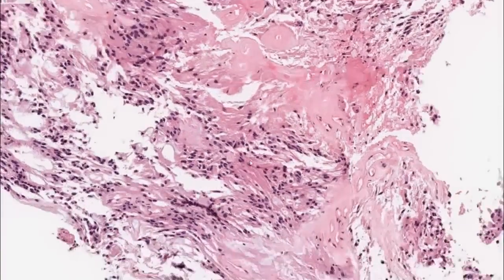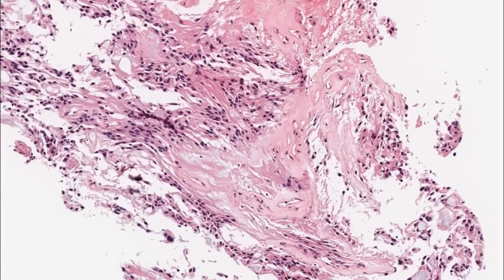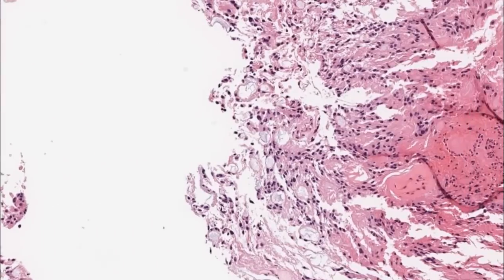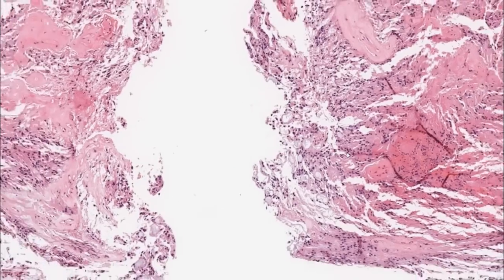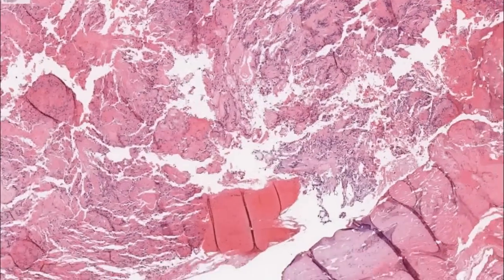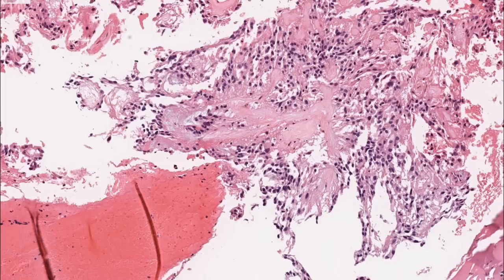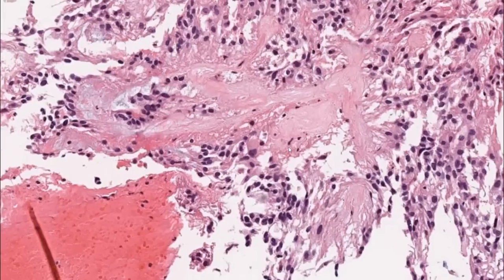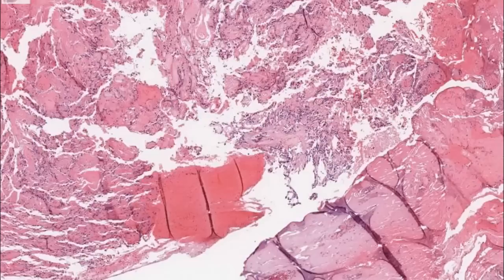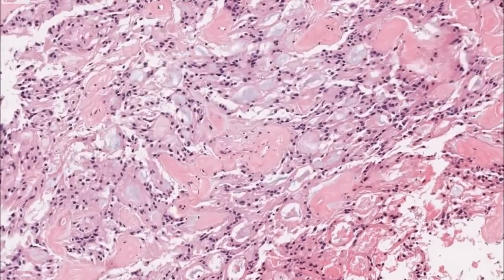So there are a lot of features here that are helpful. You can see here even better some of these cell processes going to these hyalinized vessels, and a lot of these cysts. So this is a myxopapillary ependymoma. It's something that occurs at this site almost always, the distal spinal cord in association with the filum terminale, occasionally with some of the nerve roots. These tumors can also occur in the soft tissues unassociated with the spine. But when you have it in the spinal cord, these are typically, by definition, WHO grade 1 tumors.